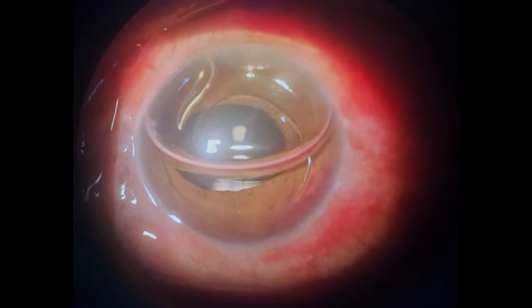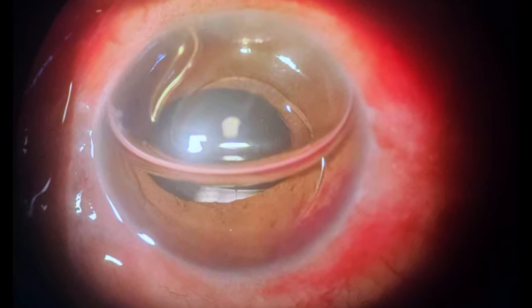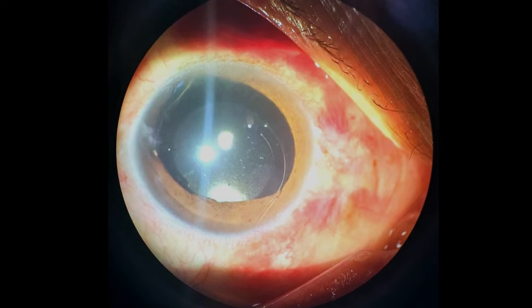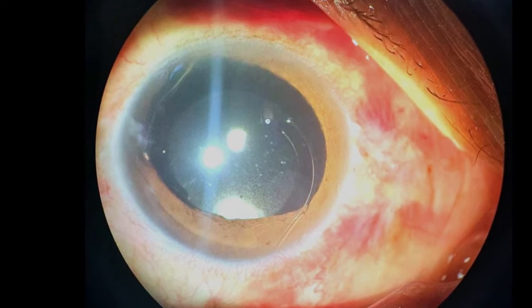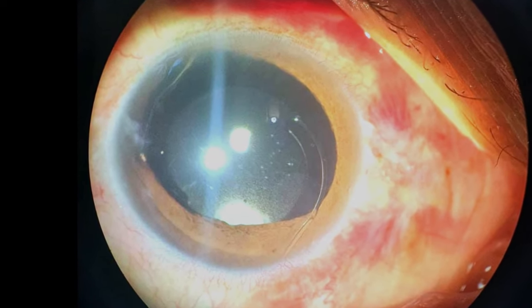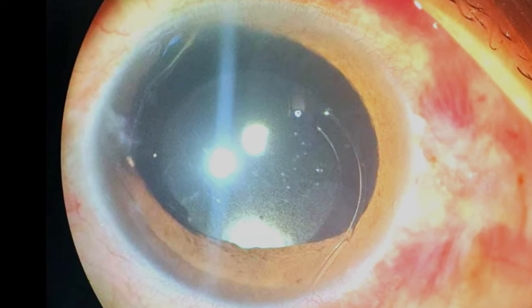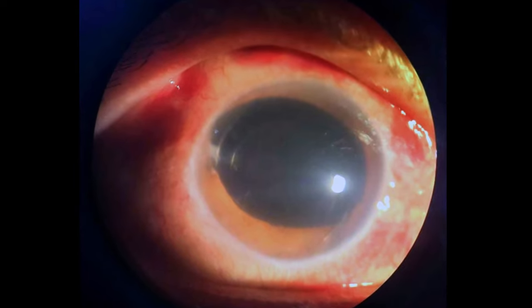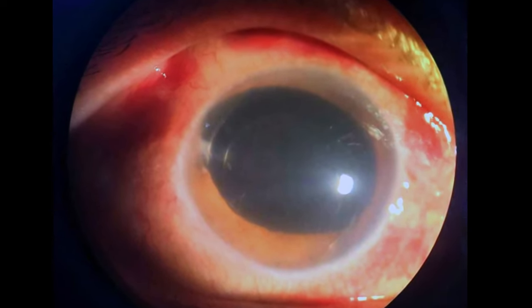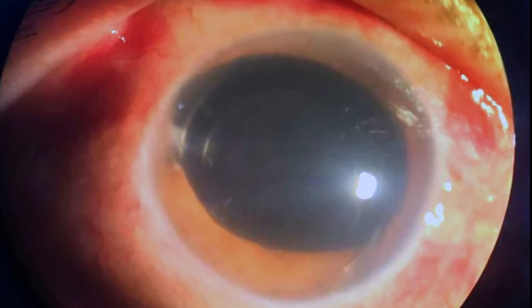The post-op picture on day one shows the air bubble in place. On day two, the air bubble has been absorbed and the pupil is fully dilated with the AC IOL in place. On day three there is some defocusing, however the patient was doing well.